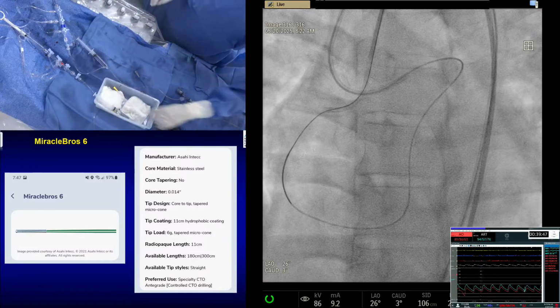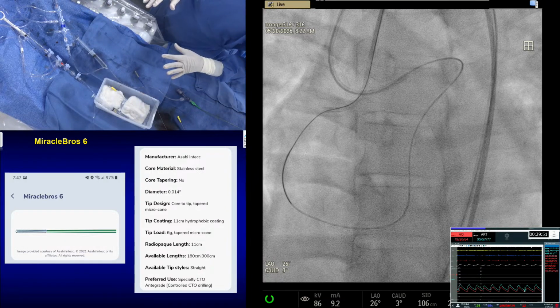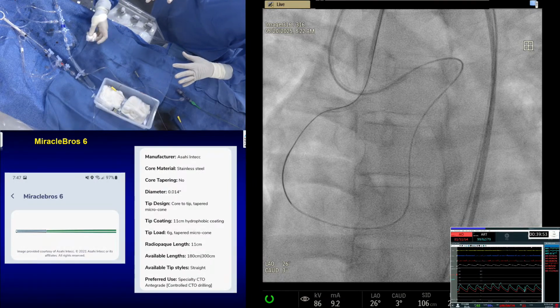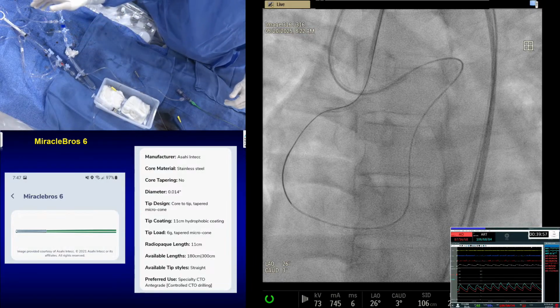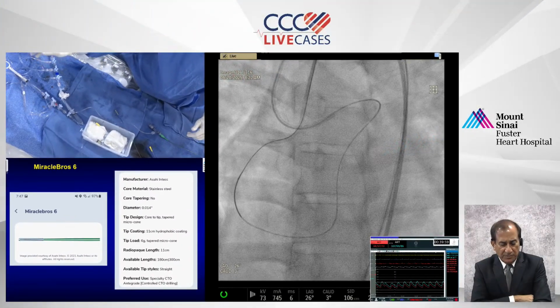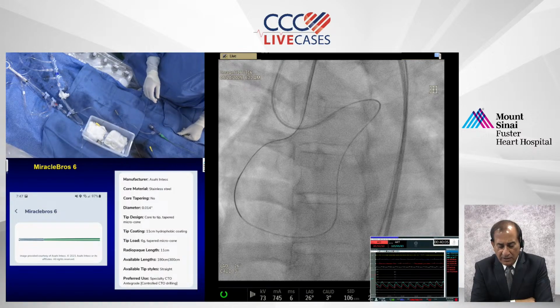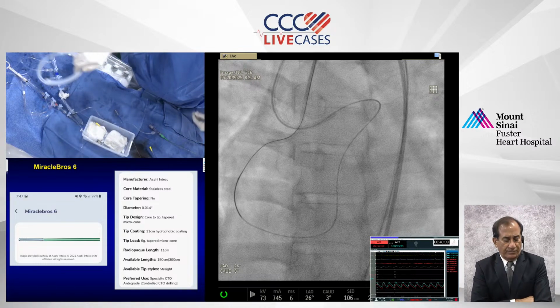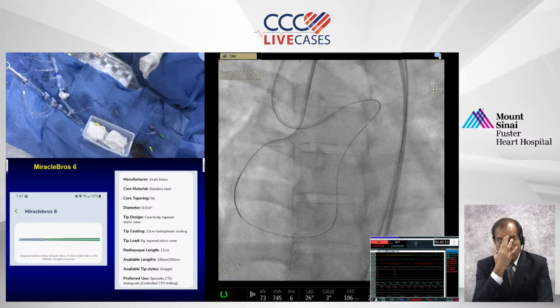Anu, a lot of people are congratulating you here. Thank you. Excellent job. Hats off. Samin, there's a very pertinent question. I'm going to read it exactly as it is. Dr. Mahmood El Rais: What is your view regarding putting a wire in the aorta through the left guiding to prevent ostial left main dissection or deep engagement? Yeah, so that will be... No, they want a wire here. I know, exactly.